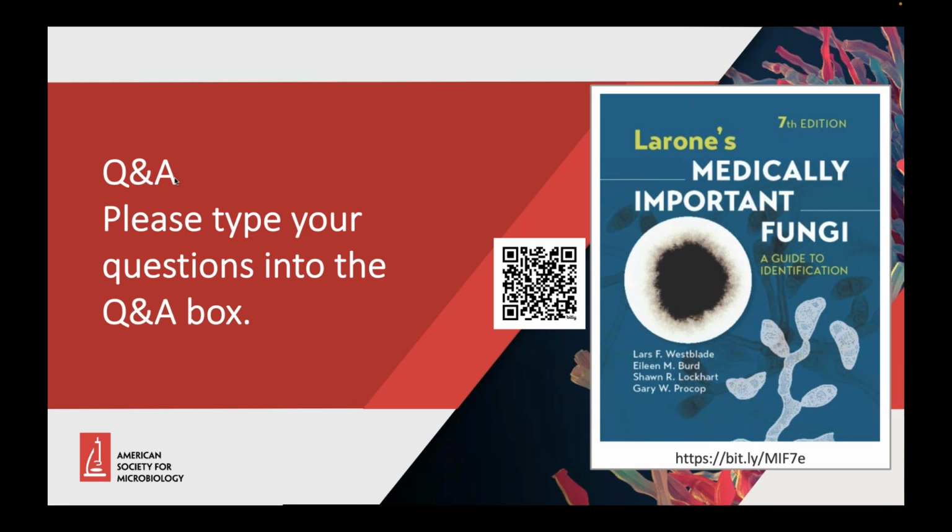So when the isolator tubes were discontinued in my lab, we moved over to the mycolytic bottles for things like Histoplasma, for Scedosporium, for Fusarium. Just remind you that you will hardly ever recover, if ever, Aspergillus or Mucormycetes in blood cultures. They're angioinvasive, but we just don't detect them in blood cultures. So really, it's down to the mycolytic bottle. I'd love to hear from other folks what tricks they've come up with.